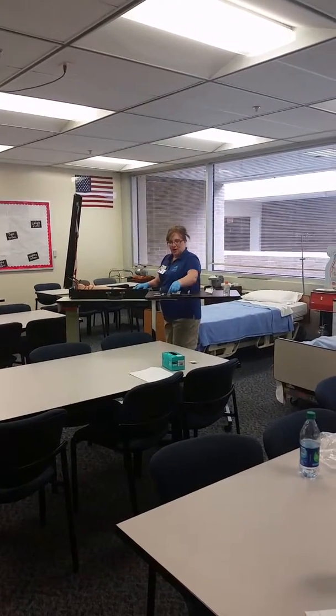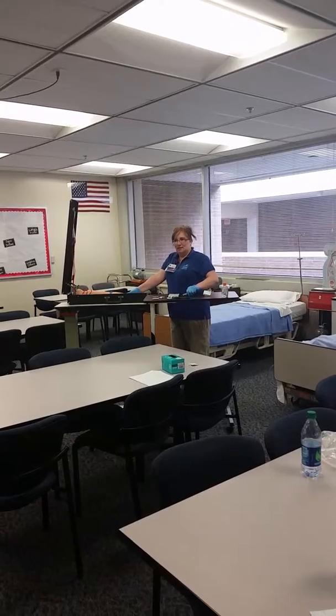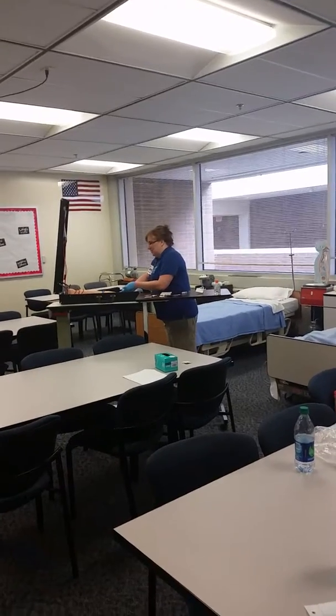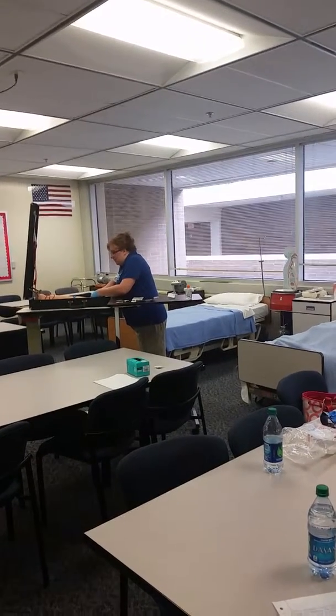I will let it dry, and then I will stabilize the vein, making sure not to touch the area that I have cleaned. I will pull it taut. Okay, I will tell the patient that they're going to feel a sharp stick. I'm going to insert at a 15-degree angle with the bevel up.